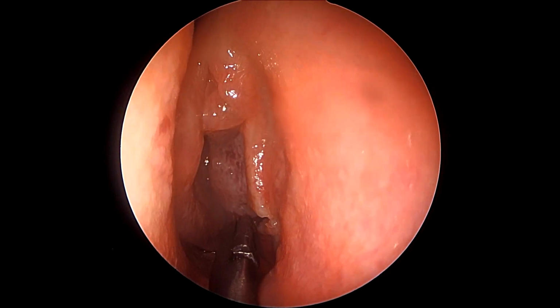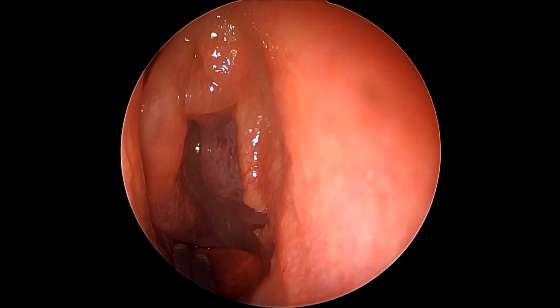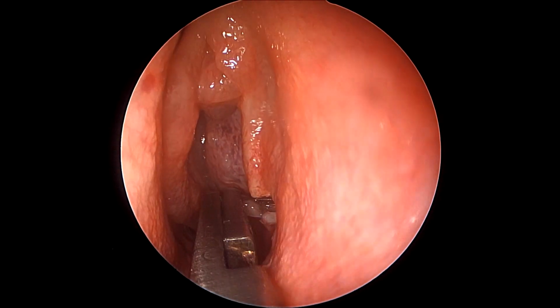Now we come to the left side, and on the left side, just as last time, we will initiate using an uncinectomy.